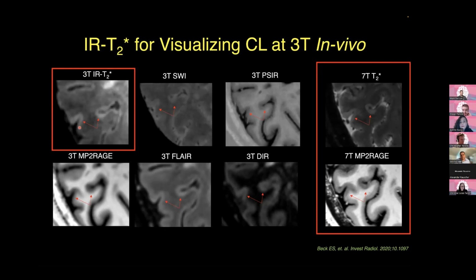However, there are studies that are doing it. There is also a study looking at changes to the curvature of the cortex, which may be a little more detectable because of all these changes happening. There are also studies done on T1 over T2, the Van Essen, Matt Glasser way of looking at lesions. There are various studies that look at it, but what I'm getting at is we really need high resolution to say something about an individual.